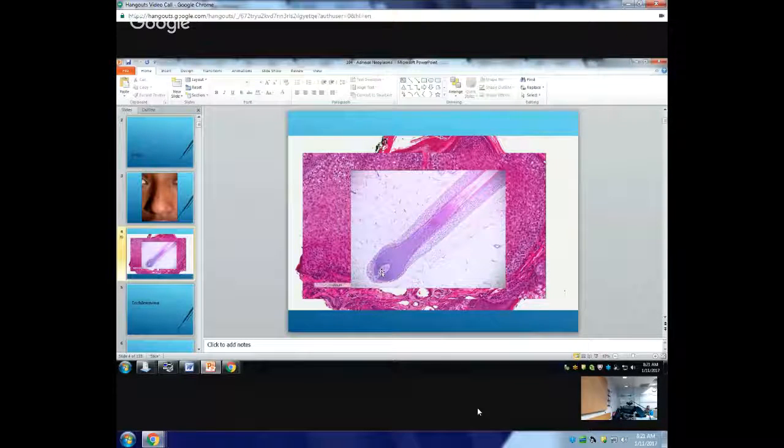This is the dermal papillae. This part is known as the papillary mesenchymal body. No? This whole thing is known as the papillary mesenchymal body. So what do you have in the papillary mesenchymal body? You have the basaloid nest and the dermis going within the basaloid nest. So you are going to see similar structures within the trichoepithelioma.